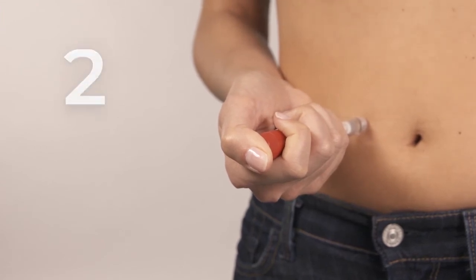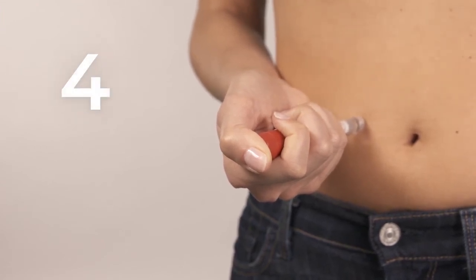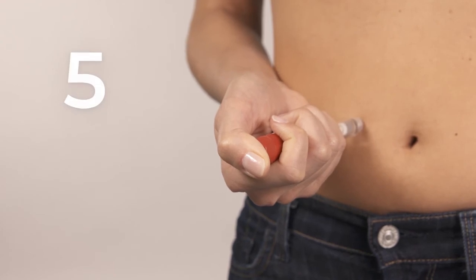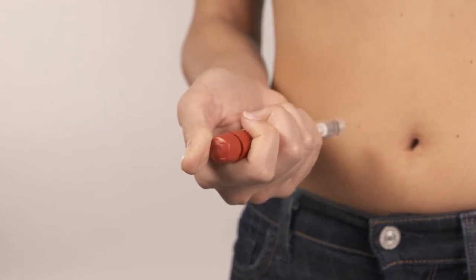Hold the dose knob down for a slow count of five before you remove from your skin. One, two, three, four, and five. There. Remove the needle from your skin, then release the knob.